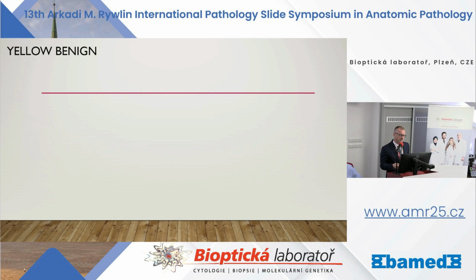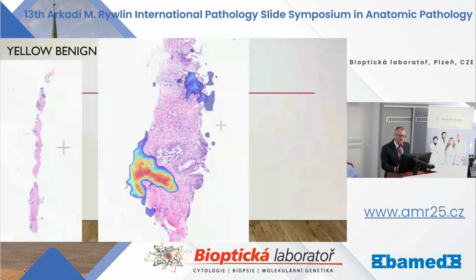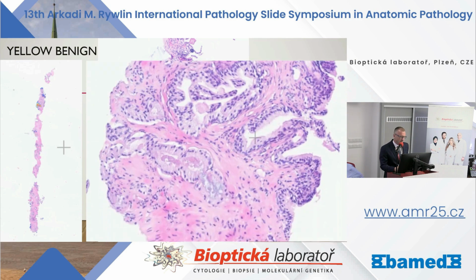And then you can get some weird yellow marked foci, even outside of any tissue, just somewhere on the slide, which are completely benign. In this case, it looks a little bit suspicious. Again, some blue mucin. You can't really be sure about any basal cells, so in immunohistochemistry, completely benign.